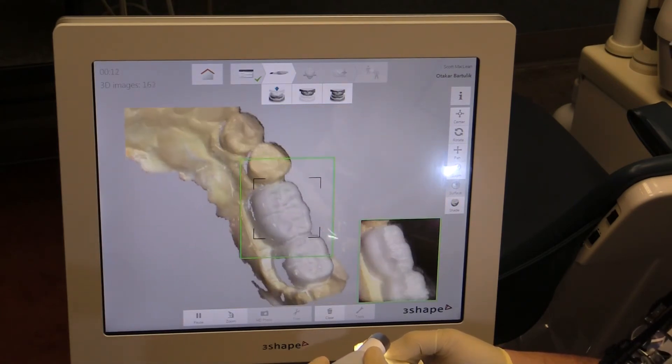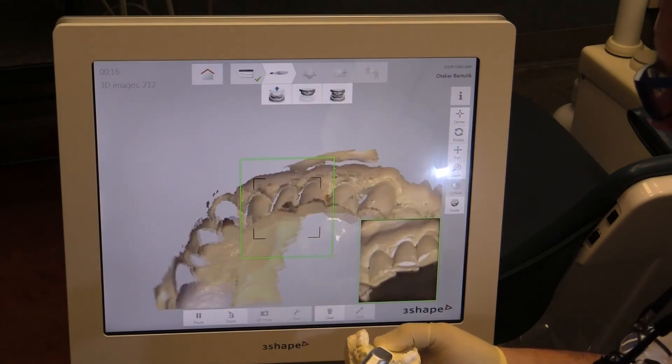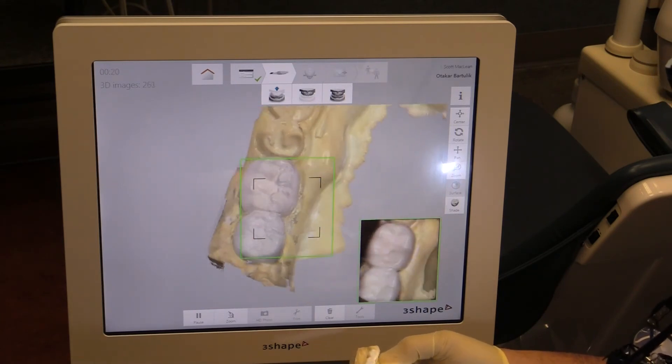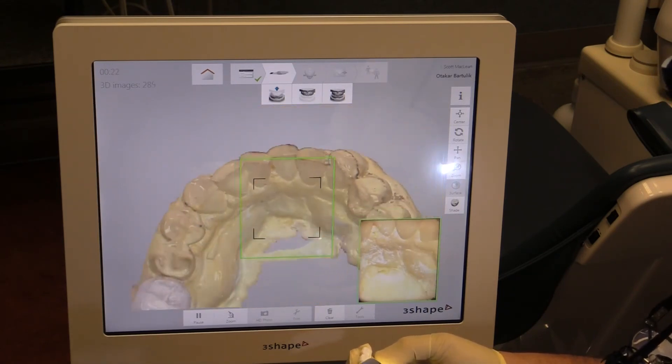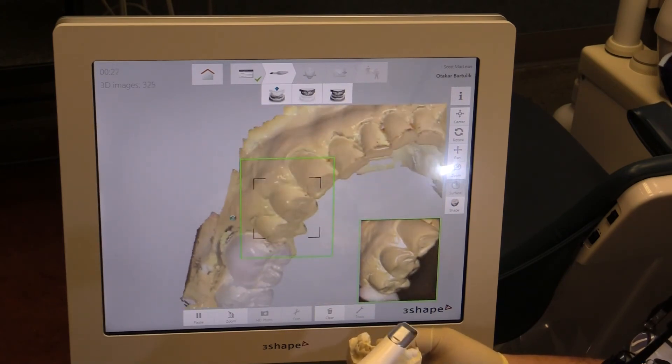You can see how fast this is scanning the model — this is real-time: 14 seconds, 16 seconds. This is just amazing technology. If you haven't looked at intraoral scanner options, start checking it out. It's pretty cool — you can bring these STL files right into Nobel Clinician to do implant planning or other planning like digital smile design.